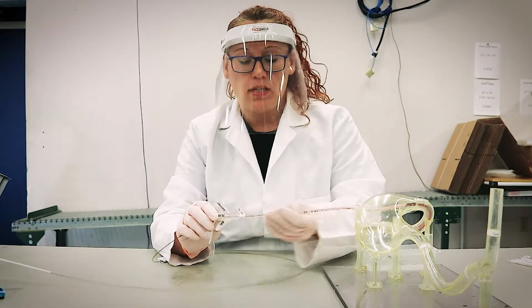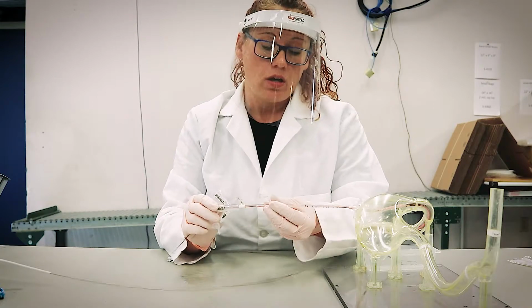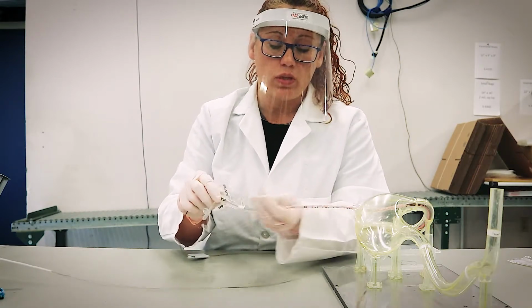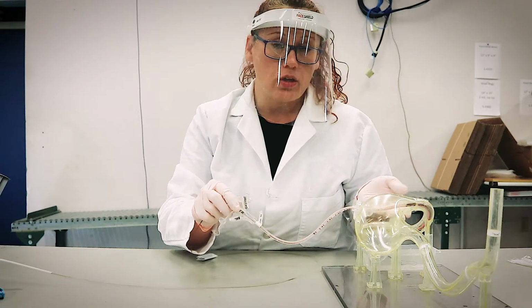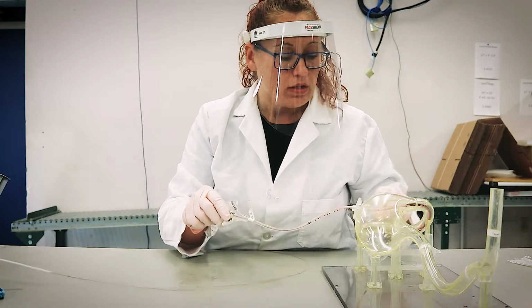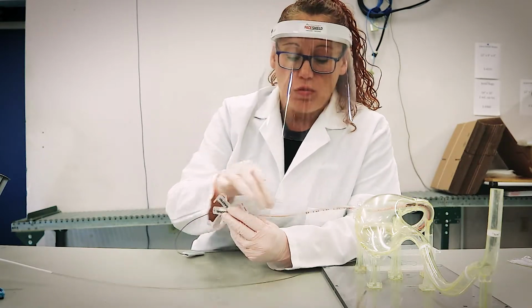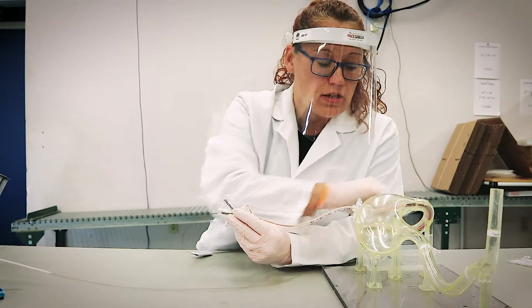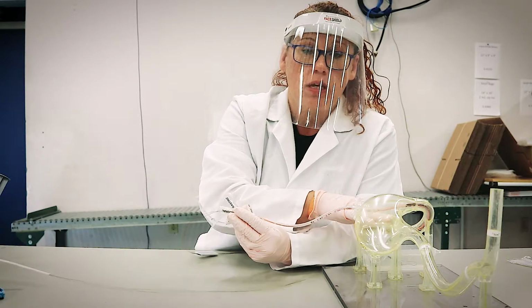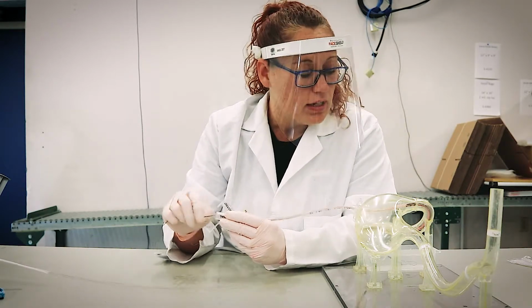So what happens with these that makes them seem a little bit more difficult and take longer is not only is some of our motion getting lost with this really long neck, the curvature in here is a little bit tighter, so that tends to be a harder spot to traverse through. So when we're losing some of our motion here, it's not making it all the way to the tip. So there's a lot less progress being made down here compared to what we're putting into it up here.